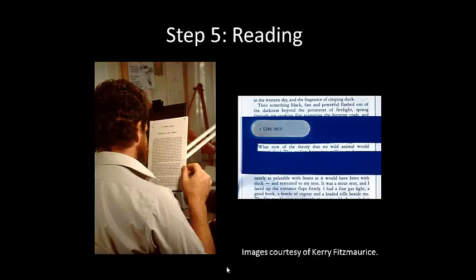And you'll notice that the line guide is just pretty much a piece of dark cardboard that has a hole cut in the middle of it. And you can easily make these for your patients or give them instructions on how to do this themselves. And what it does is it isolates that one sentence, and so there's no distractors superiorly, inferiorly, and that facilitates reading.